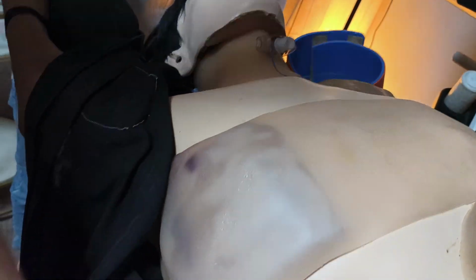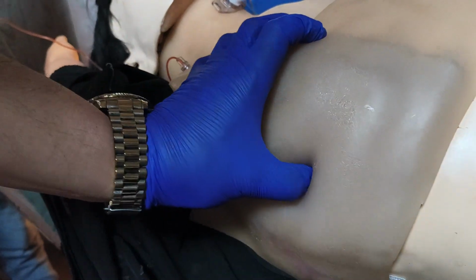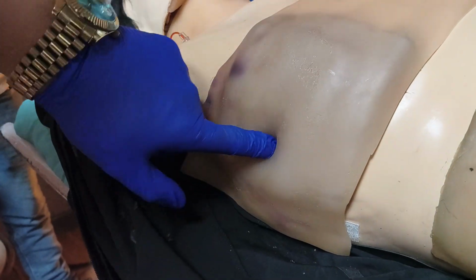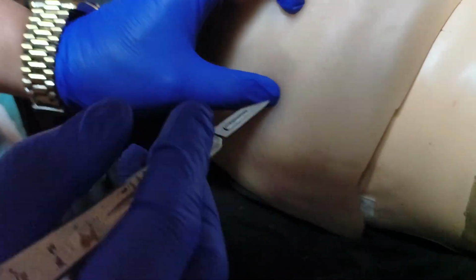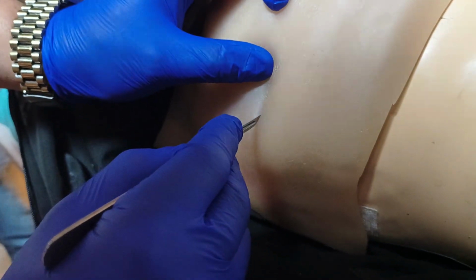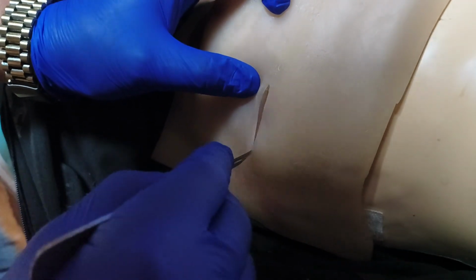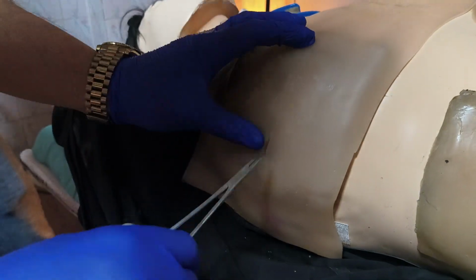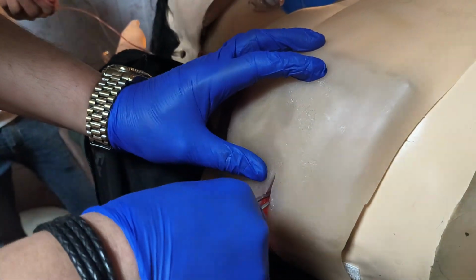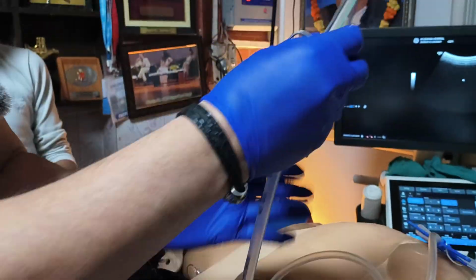Okay, so now we will show hemothorax. So now I'm simulating the scenario for hemothorax. Okay, so just anterior to the mid-axillary line, upper border of the lower rib, 1 inch, at least 1 inch, skin and subcutaneous tissue, then the cannula, the puncture. Okay, so there is the blood, and then we will insert the tube.